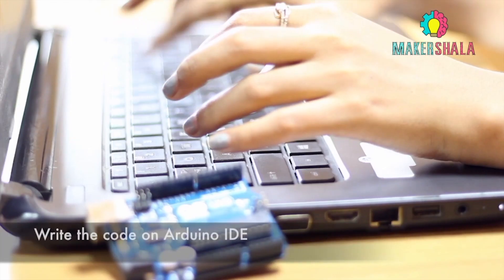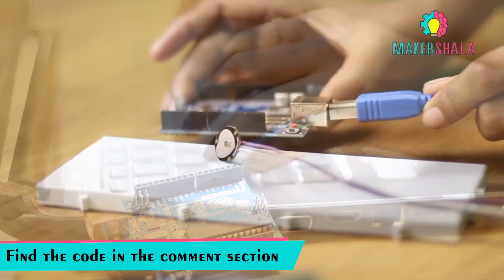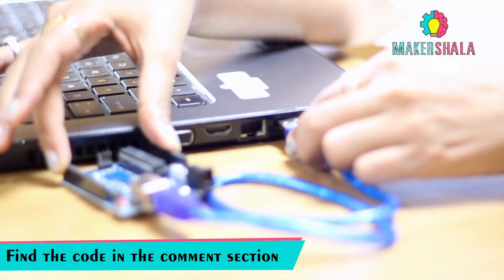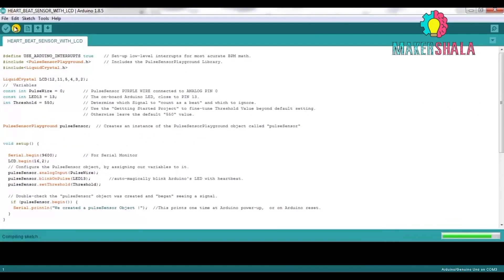Got your materials? Begin by writing the code as instructed in the Arduino IDE. After you have written the code, connect it to the computer using a USB A to B cable. Click the upload button to compile and upload the code.